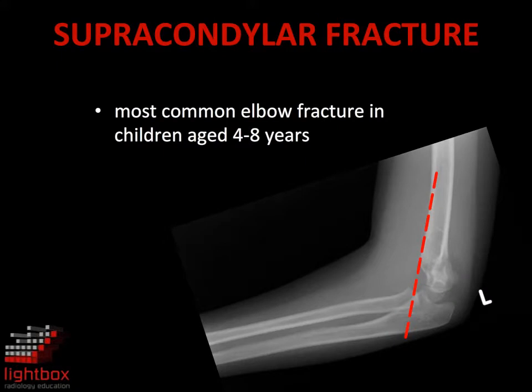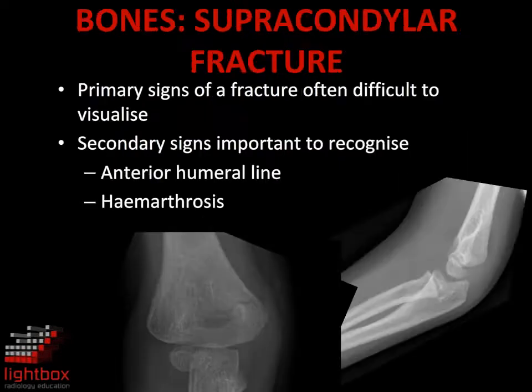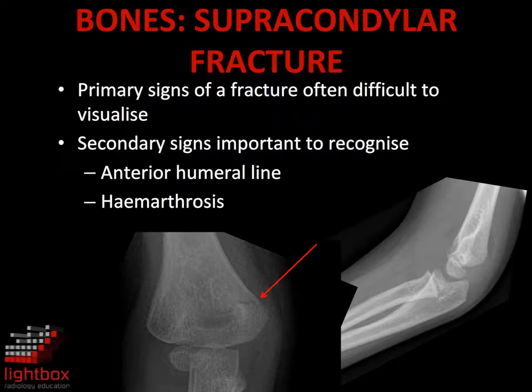Supracondylar fractures of the distal humerus are the most common fractures in children aged four to eight. Once alignment has been assessed, the bones are the next region to be interpreted for signs of a fracture. Look for cortical disruption or a linear lucency, though these are sometimes difficult to visualise. The secondary signs of loss of the normal anterior humeral line alignment and signs of a haemarthrosis are often important in establishing a plain film diagnosis.